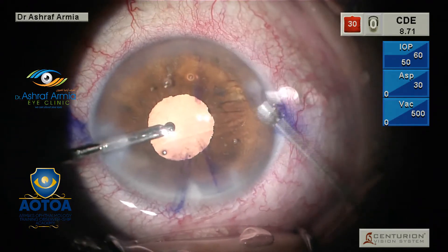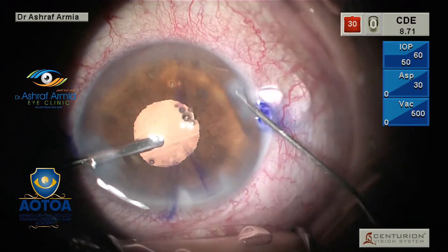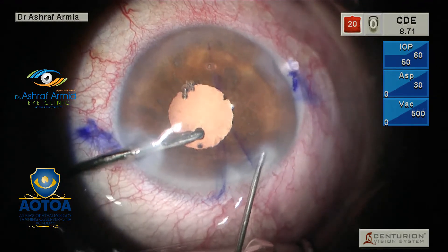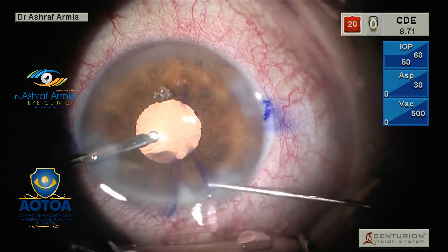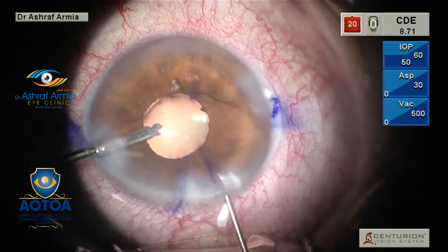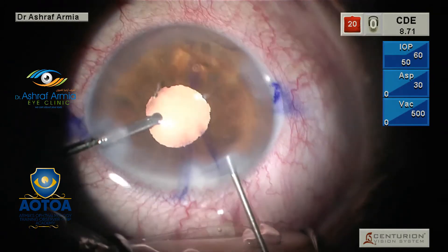A very small but important trick: don't remove your irrigation — perform full hydration of the paracentesis and the wound first. Make sure you hydrate the upper lip of the wound to ensure wound tightness, so you don't lose the proper stability of the IOL during hydration or lose stability of the anterior chamber during removal of your irrigation.